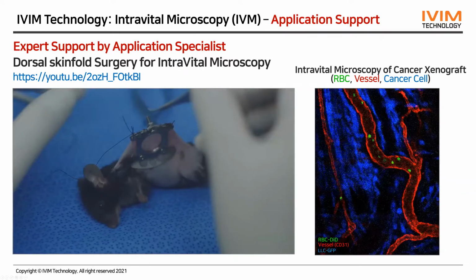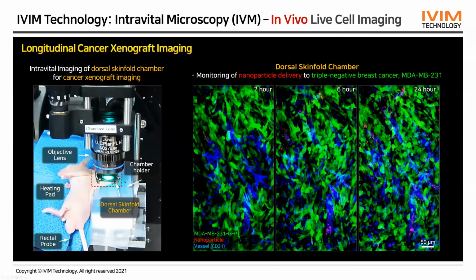Again, in this setting, we can keep the animal stable for a very long time. So this is the monitoring of nanoparticle delivery to this triple negative breast cancer model, MDA-MB-231 GFP. This is 2 hour, 6 hour, and 24 hour imaging at the same site after the injection of this nanoparticle.